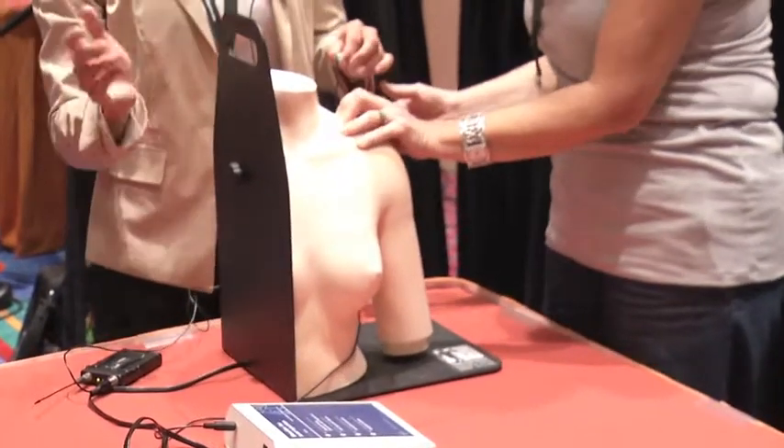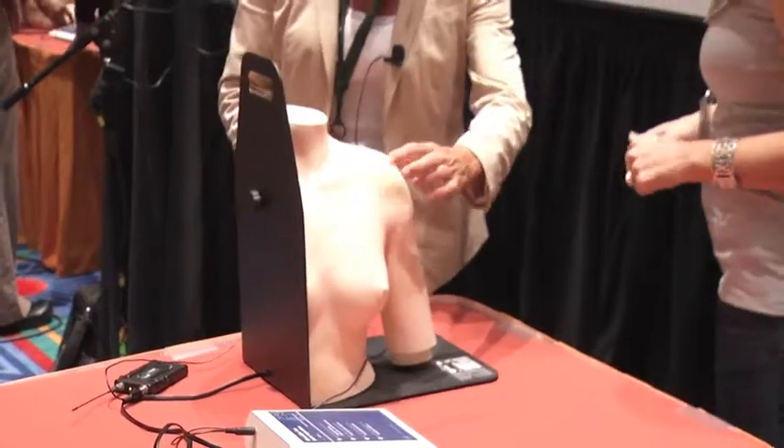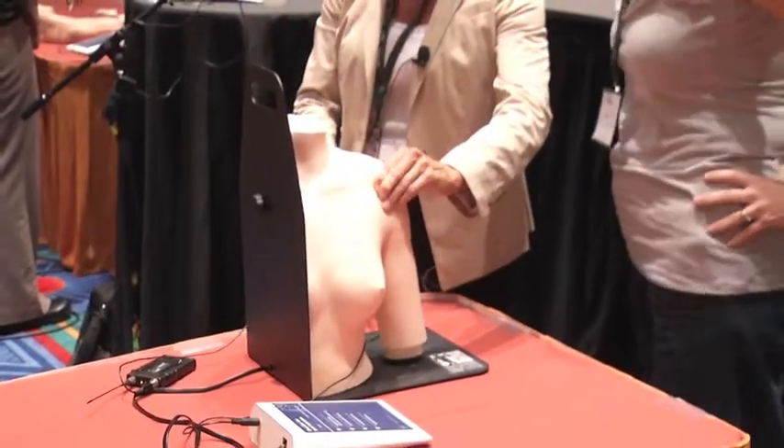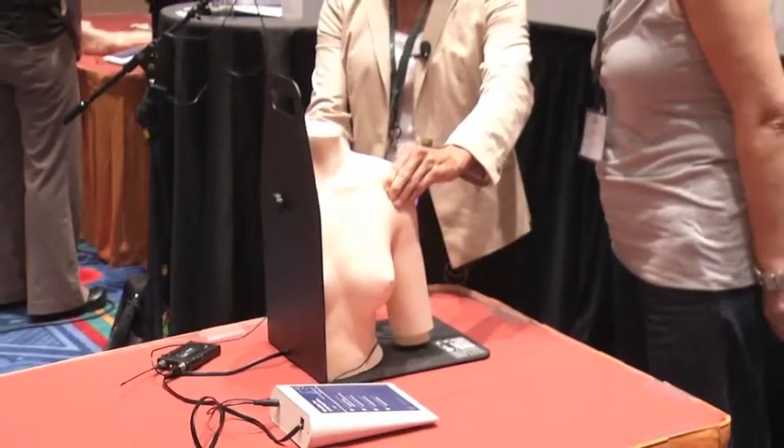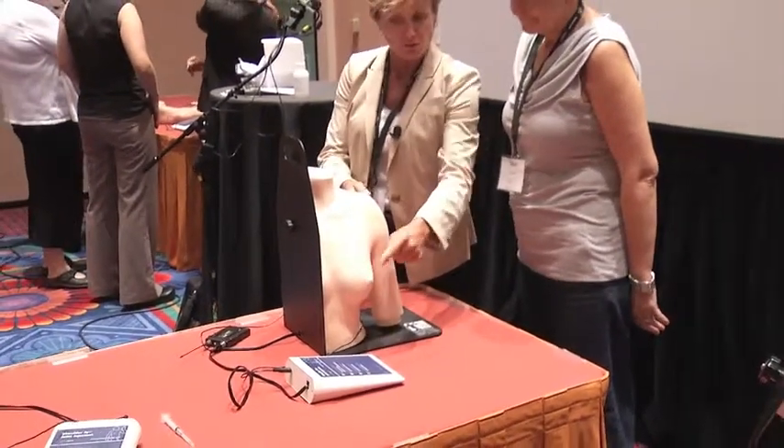She's disappointed because she's been showing off all day — she's done a great job — so she's going to come back, palpate the acromion, reach up front, get your coracoid, right a finger below. Remember we got a cheater crease right there, we're going to come in right here, and it should light up — and there it is, subacromial space.